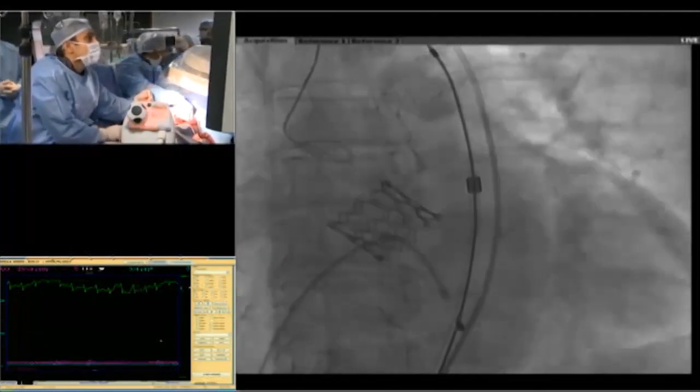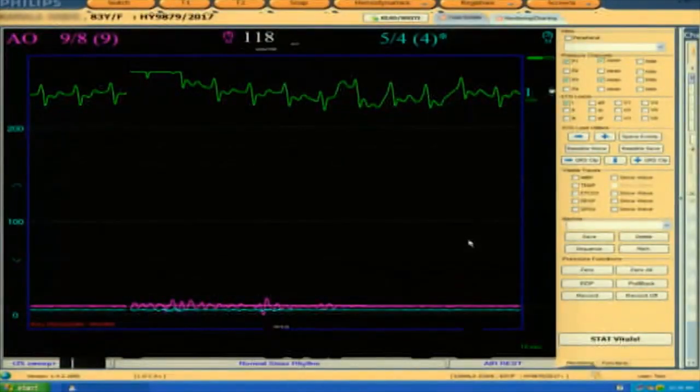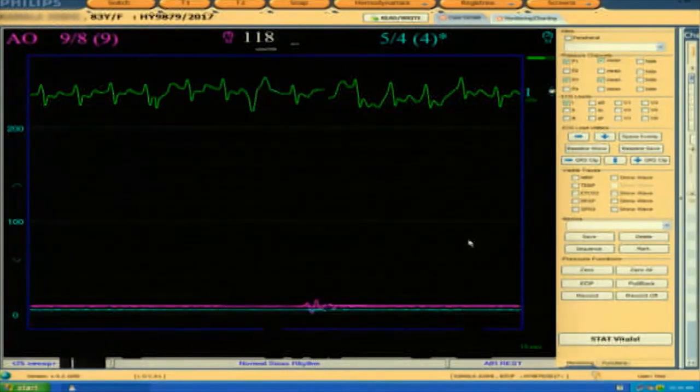We'll just get the pressure. What's the pressure now? How much is the pressure? Show us the pressure on the hemodynamics, please. We're going to have to connect to the... All right, 185. Okay. 185. That's fine. All right, we'll do an aortogram here. Our pressure is 180/75. Fluoro.